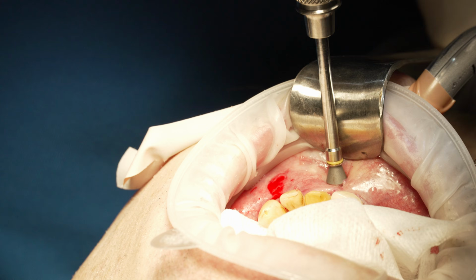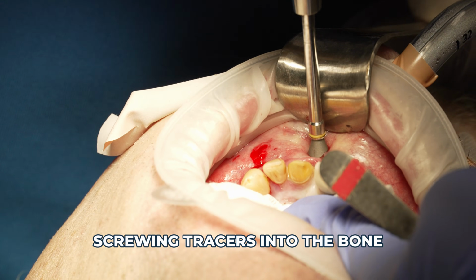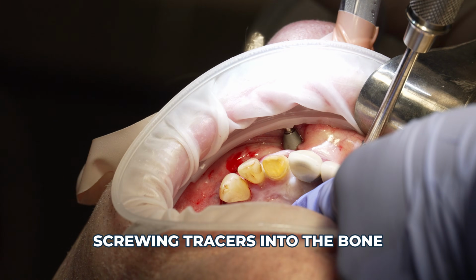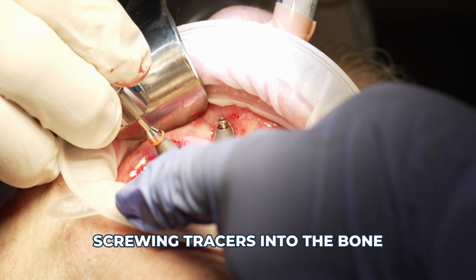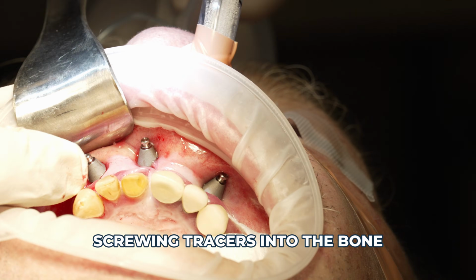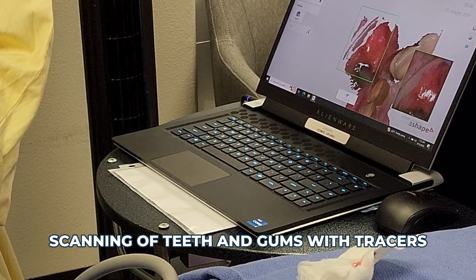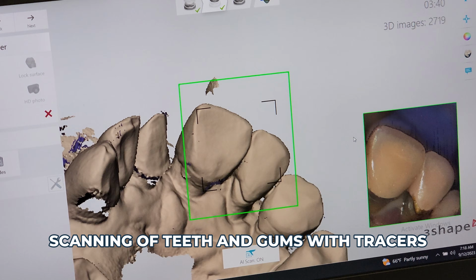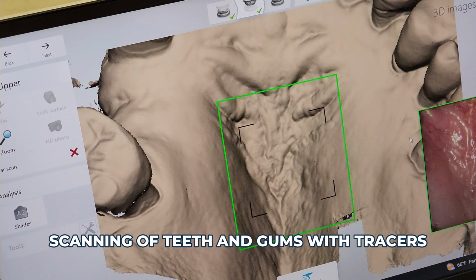So that's where these little things called tracers come into place. We first screw these tiny tracers or tiny little mounts into the bone of the patient. After these are in place, we take a scan with them and the teeth still in the mouth. So with these hard fixtures in place in that scan, we can then line up the solid teeth to these solid tracers in the software. So now we can superimpose all the future scans that we're going to be taking to the past scans because we have these solid tracers in the mouth.